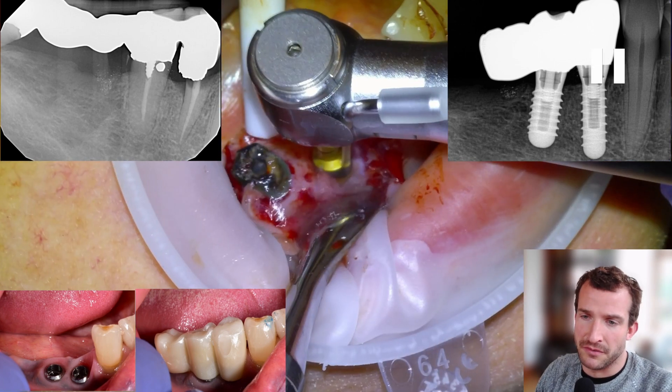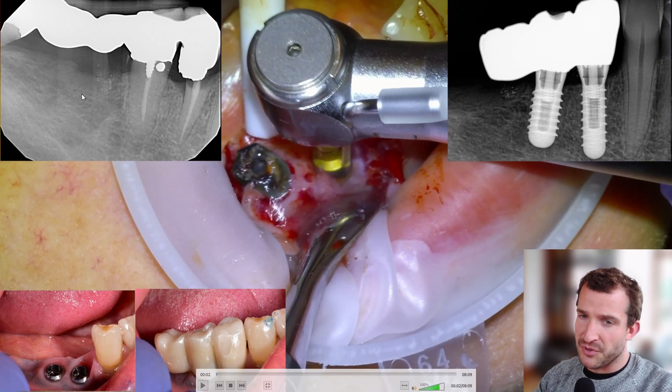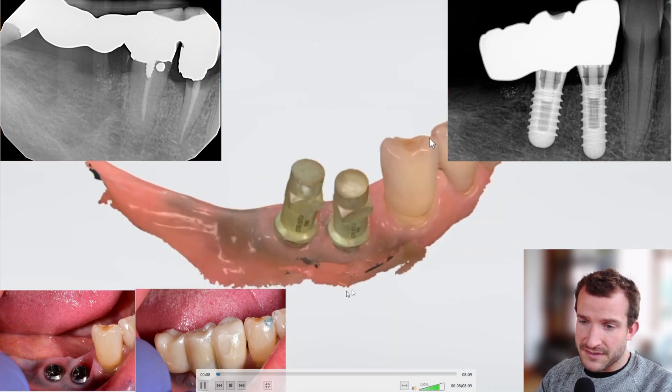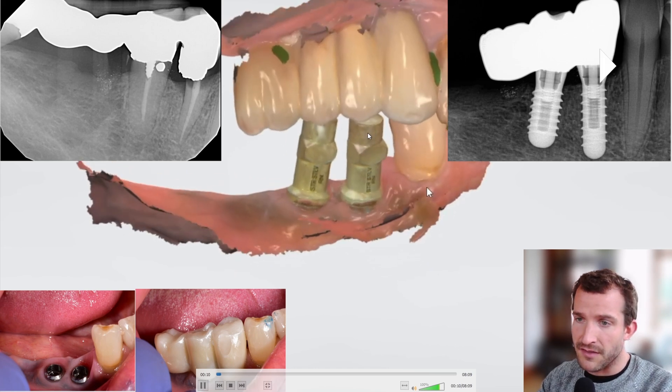Hey guys, it's Dr. Dobson. I'm going to be going over an implant case that we did in this video. This is a quad 4 bridge that failed — massive decay on the 4-4, the 4-7 abutment was abscessed — so we're basically going to do an immediate implant surgery, place two implants, wait three months, get a scan. Here's the pre-scan, and then there's the scan output.